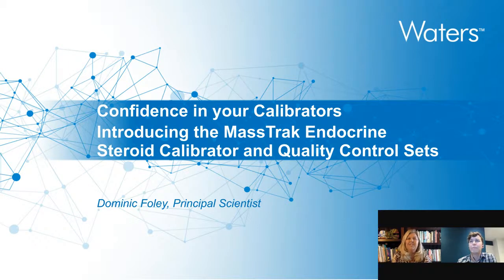Our second question coming in: the method to demonstrate performance of the calibrator and quality control set used solid phase extraction. Are there possible alternatives that could be used for sample preparation of these steroid hormones? Yeah, so we commonly use solid phase extraction techniques for our steroid hormone analysis.